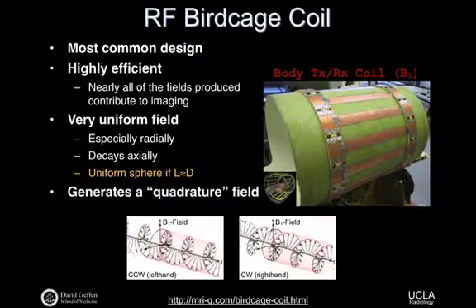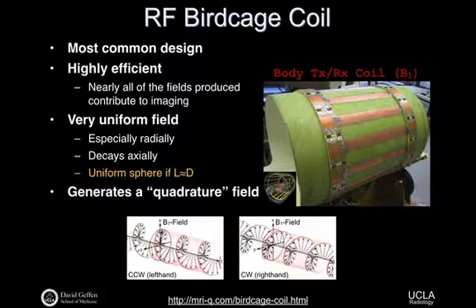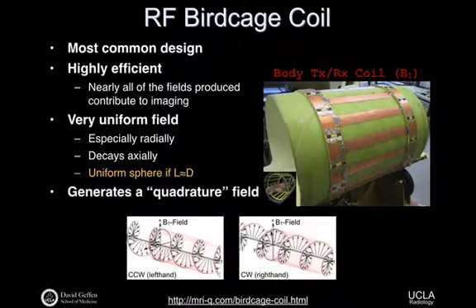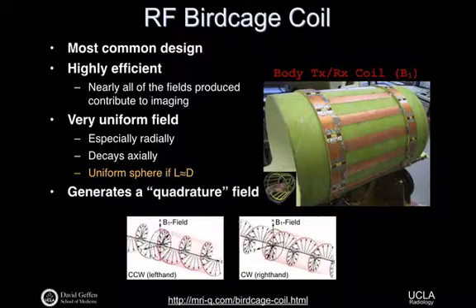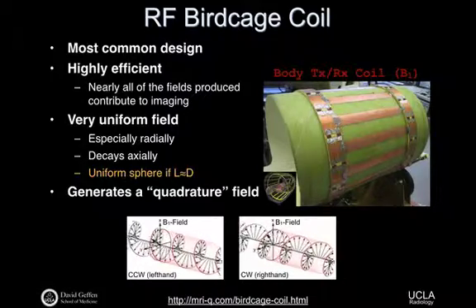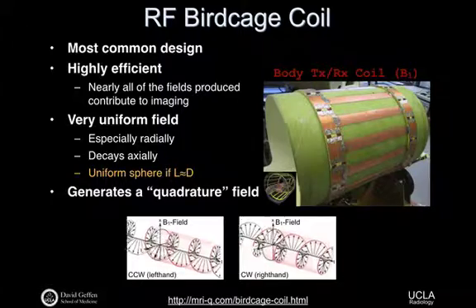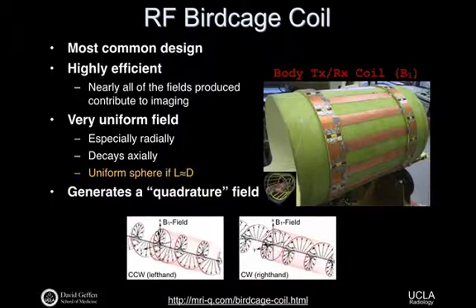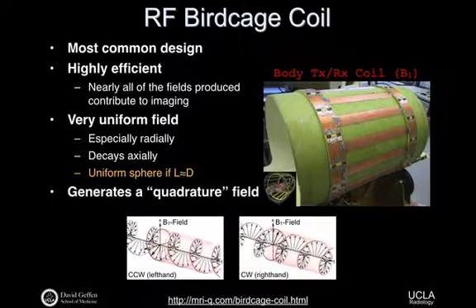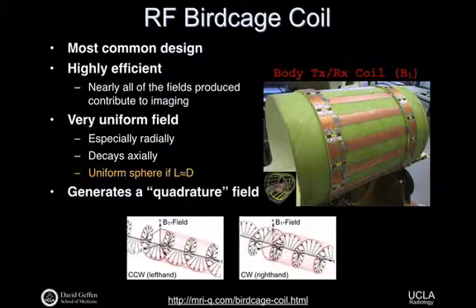Yes, please. The length represents the length of the coil, in this diagram here? Yeah, this is actually time. That's a great question, so not very obvious. The idea is that, let's say X and Y here, this point represents isocenter. At isocenter, if you just watch this circle here, you'll see this bigger vector is rotating around. That means at isocenter, the B1 field is constantly pointing in a slightly different direction, right? It's a little bit of a confusing diagram, but I either have to remake it or take it from, I think, Wikipedia.